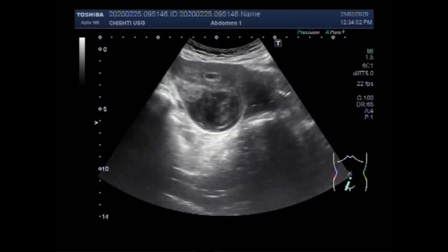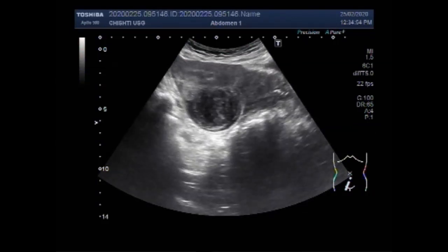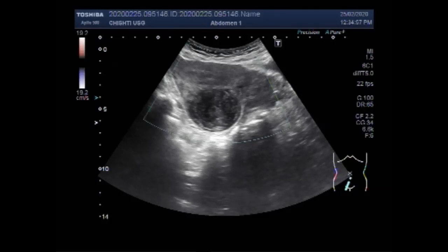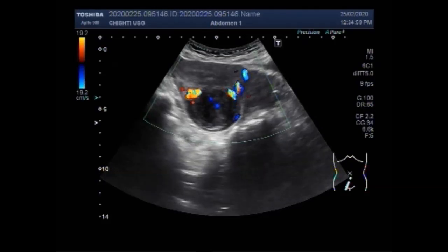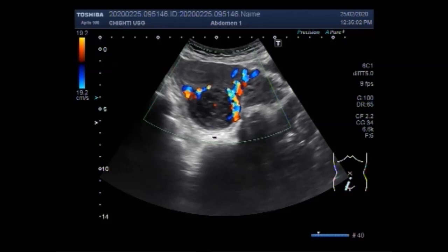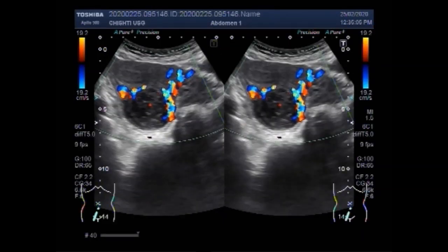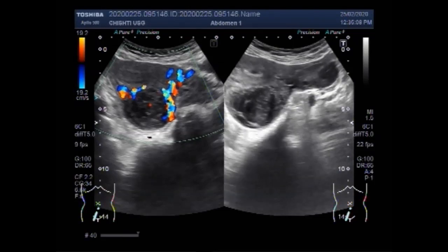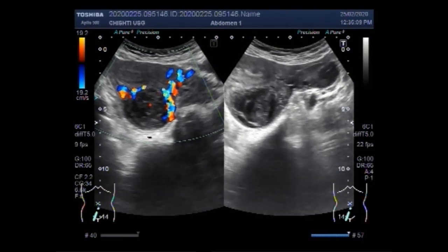Vigorous blood flow is seen in the mass, which is heterogeneous. Blood flow in the rim region is visible along with blood flow in the center portion of the mass.